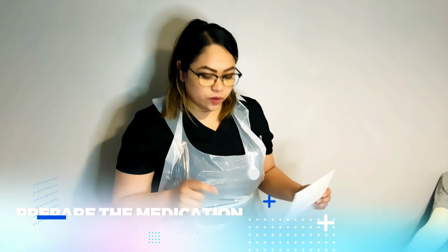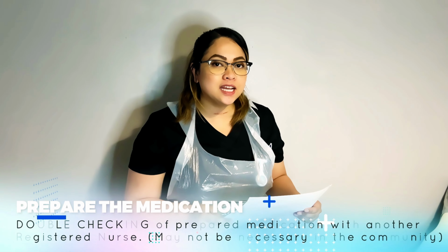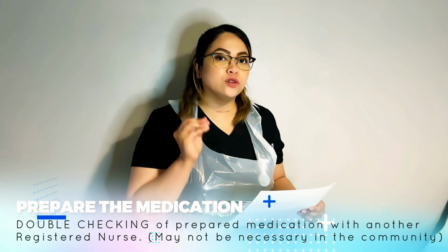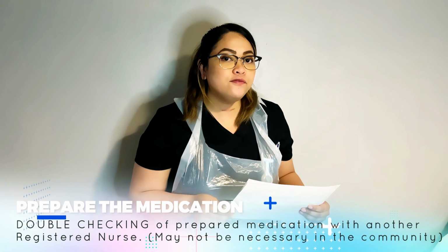As you've noticed, I didn't do a double checking with the medication because we are in the community setting, okay? It's not gonna be necessary and the examiner will tell that to you even before you start this procedure. But if you are in the hospital setting, you have to ask another registered nurse to check if the amount that you've withdrawn is correct. So I'm ready to go now to the patient side.